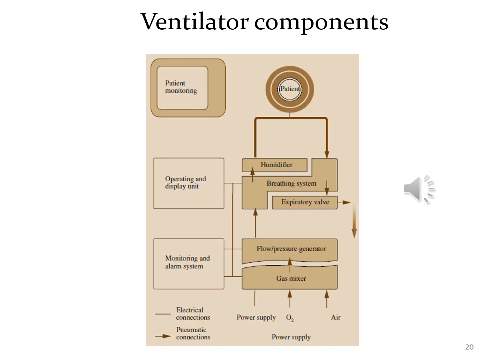The ventilator components are power supply, gas mixer, pressure sensor, flow sensor, pressure flow generator, breathing system, gas humidifier, heater assembly, thermistor, valves, operating and display unit, alarm system, and patient monitoring.